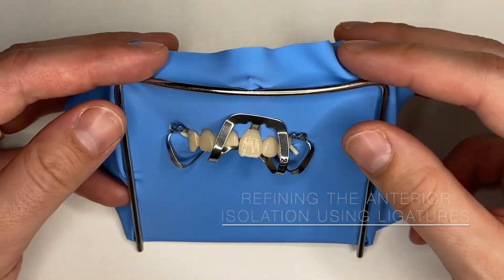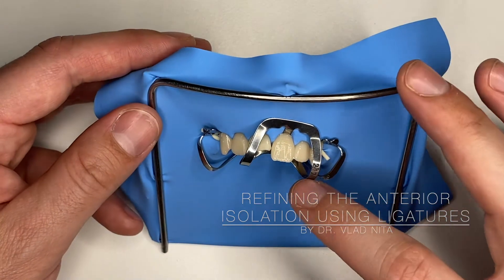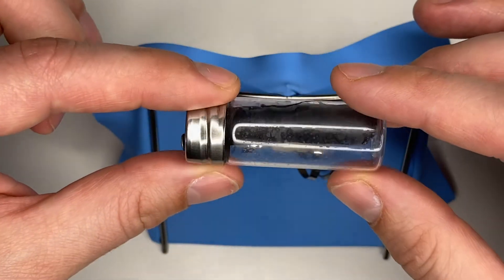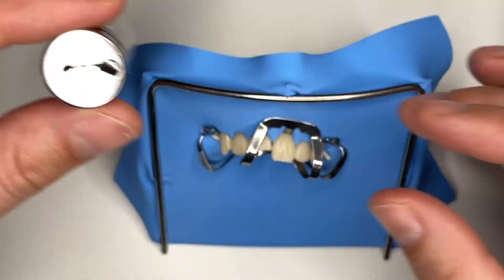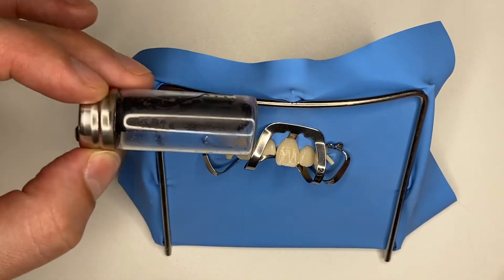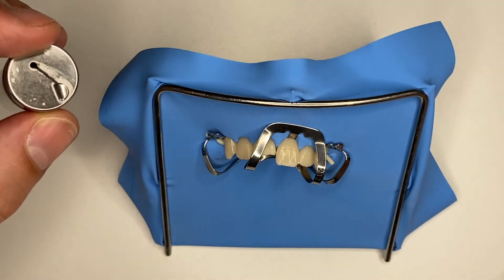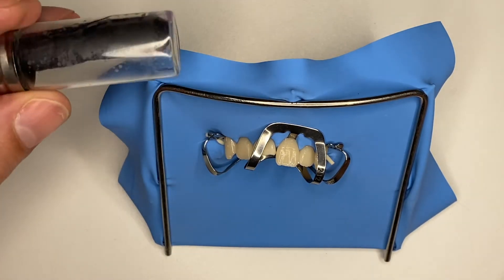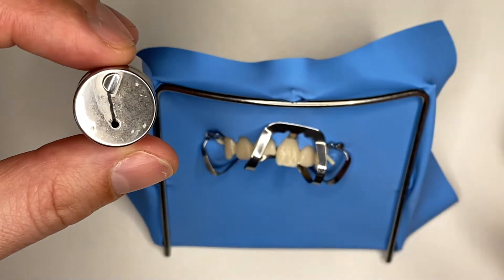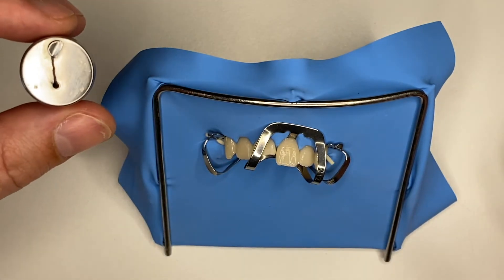Hello everyone and welcome back. In situations where rubber dam clamps may not be suitable for you, today we're going to discuss a different option. We are going to use floss, and this is a very good option because you can sterilize it. This comes from smartcard.ro — it's a black charcoal floss that comes in a steel and glass container, which means it can go through the 121-degree sterilization cycle.